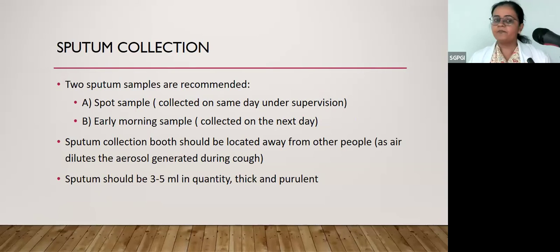Sputum sample. Two sputum samples are recommended. First is the spot sample that is collected on the same day under supervision. And the second sample should be collected early morning on the next day. The sputum collection booth should be located away from other people, as it dilutes the aerosol generated during cough.